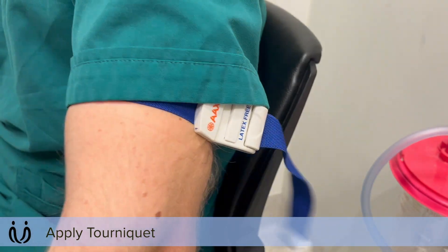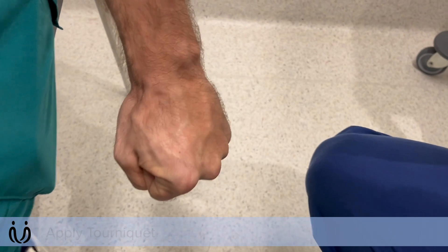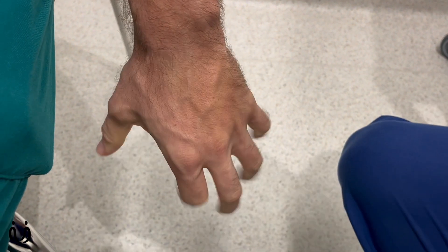Make that nice and tight. If I can just get you to dangle your arm down by the edge of the bed and clench your fist a few times — I'm just going to get your veins to stand out a bit.